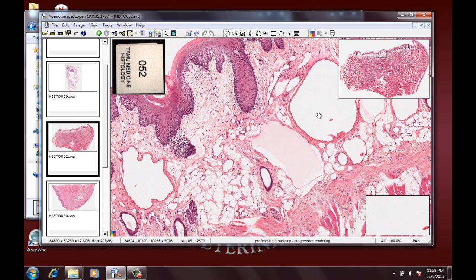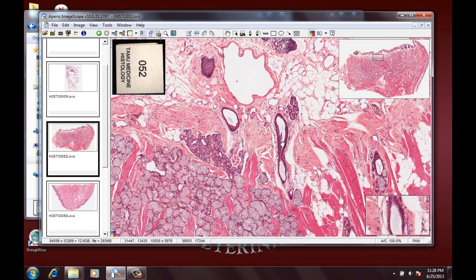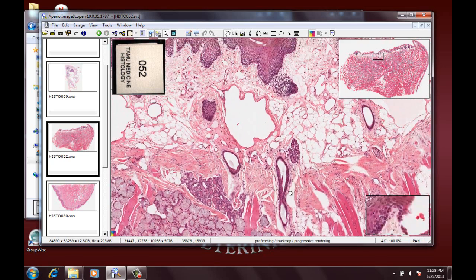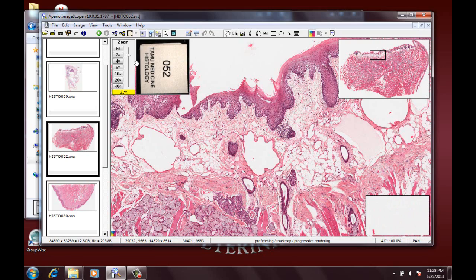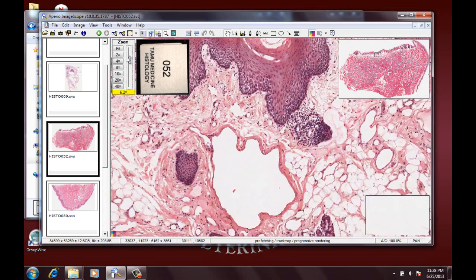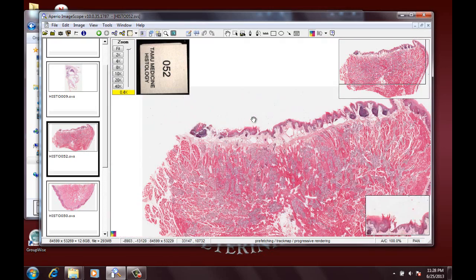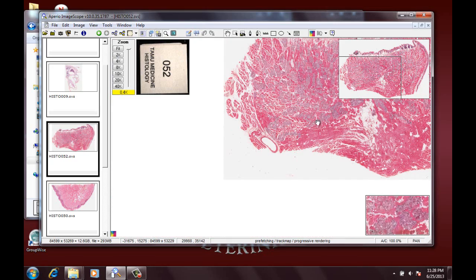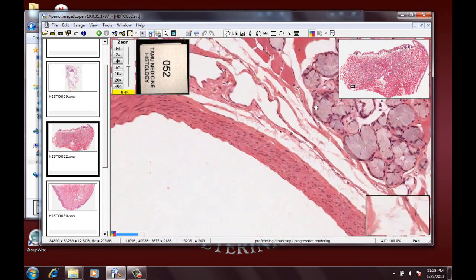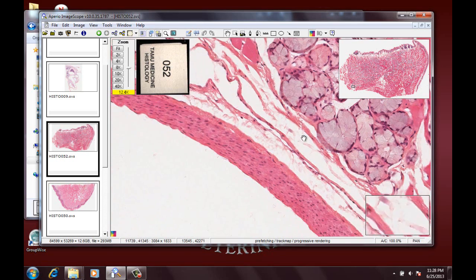Actually, this is artery and venule that we see in through there. These are the glands, and we can see ducts carrying the glandular secretions out to the surface. Also, we can click on here and it will show you the magnification. You can change the magnification right here too, but by clicking in here you can also move this back and forth, or you can move over here and look at this blood vessel. See, this is our artery right here. This is smooth muscle of the artery.